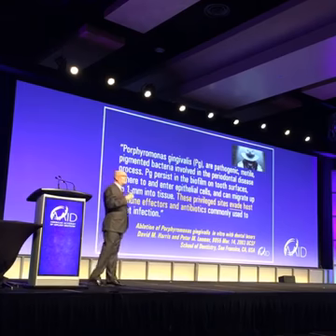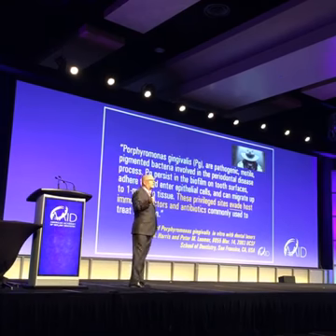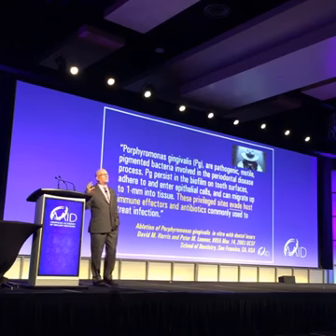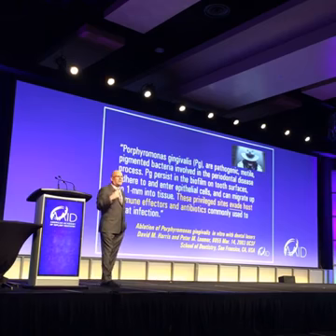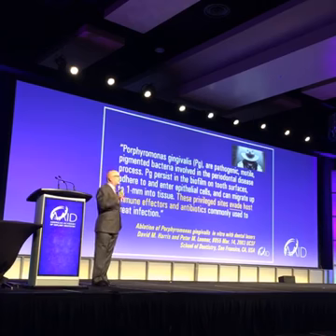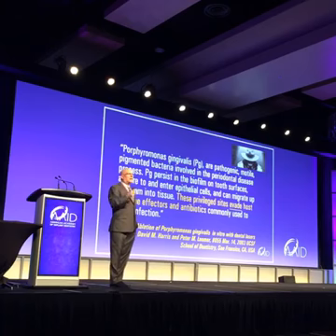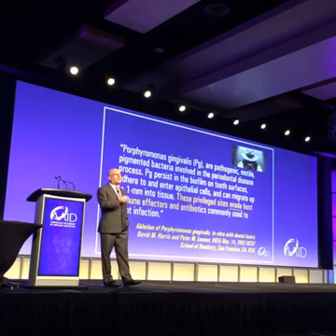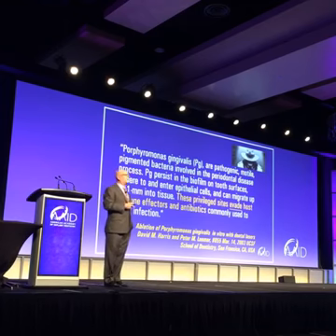P. gingivalis hides. It hides in the privileged sites. It hides in the dentinal tubules. It hides within the bone. It hides within the connective tissue. It hides within the cells. You can't get it with scaling and root planing. And you can't get it with surgery because it's hiding inside. You're not killing it. You need something that's going to get into these little sites without damaging the tissue. And because the Nd:YAG laser wavelength does not damage hard tissue, we can use it near dentin, and those photons are going to get inside those dentinal tubules. And it's going to get within the bone without damaging the bone because it's not absorbed by hard tissues.